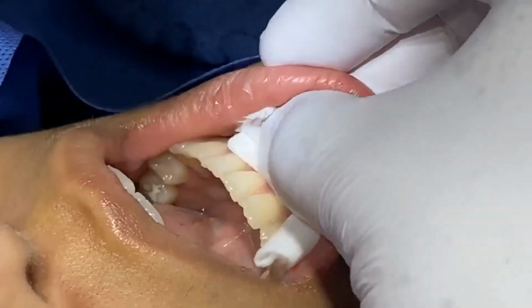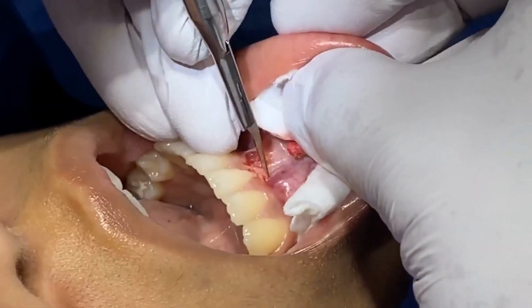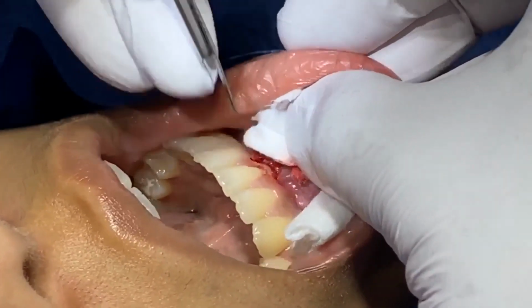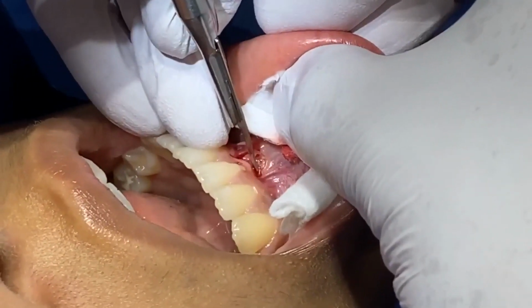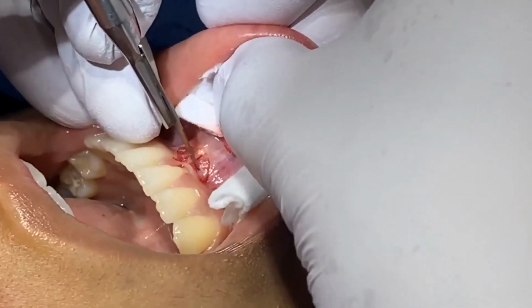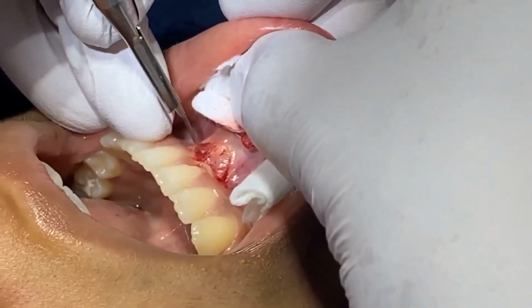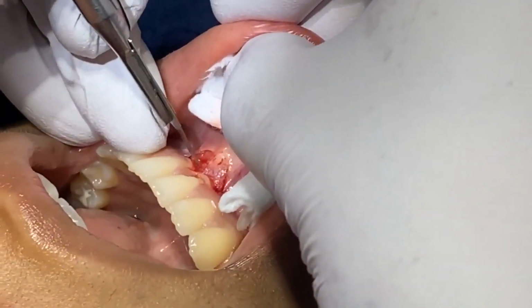Okay, so free gingival grafting was something that I used to do a lot in my early career, and I abandoned it because I didn't really see the importance until a few years ago. I started to see the benefit of an FGG, free gingival grafting. So these days I do it quite often, and it's one of the most predictable soft tissue grafting procedures that you can do if you learn properly.